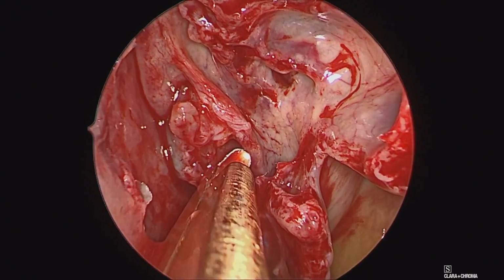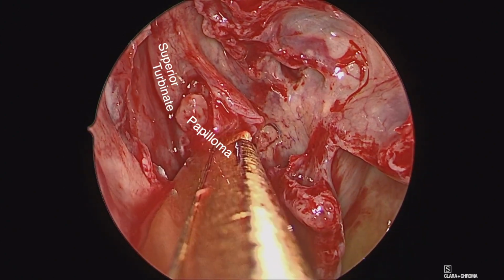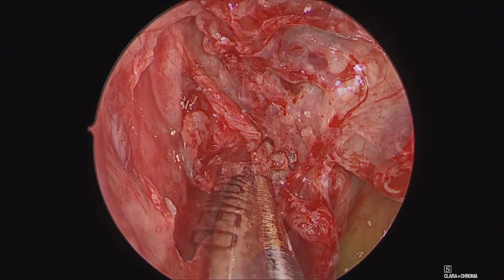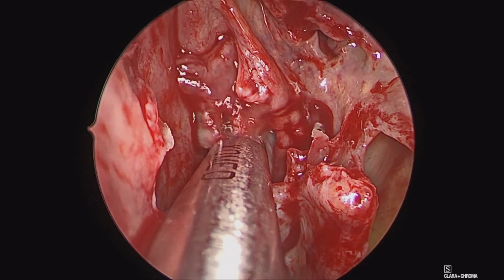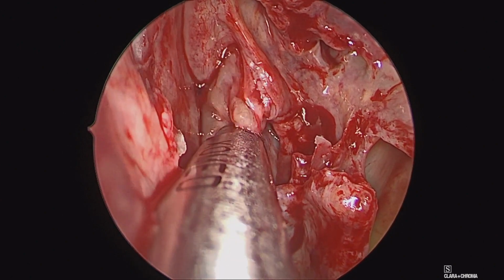This is now the superior turbinate. You can see the papilloma nearing its attachment point along the junction of the superior turbinate and ethmoid skull base. Here we are debulking a little bit of the low-hanging papilloma as we continue to work higher in this area, near the junction of the superior turbinate and a posterior ethmoid partition.